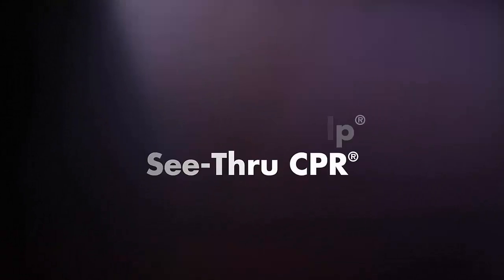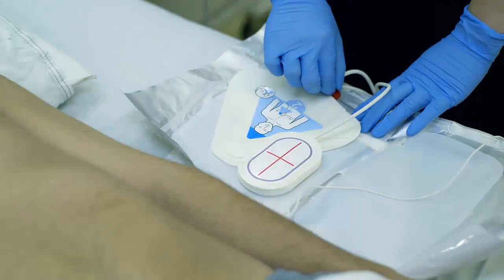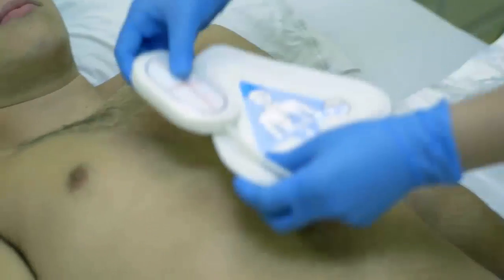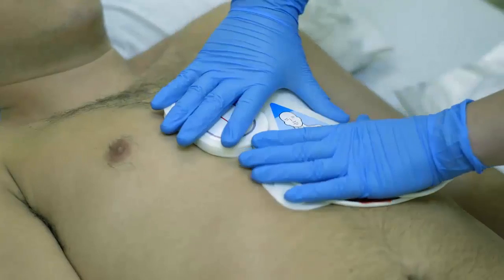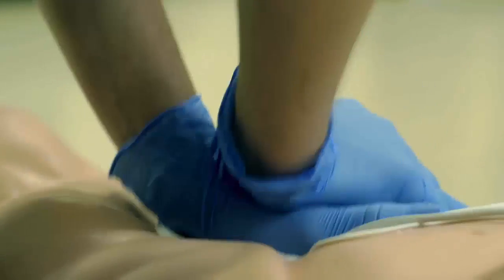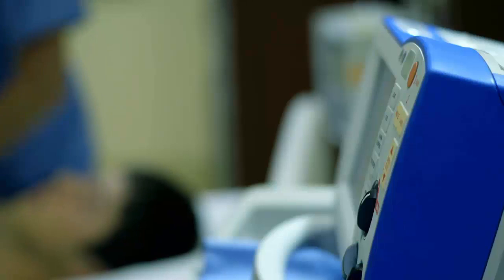Real CPR help and see-through CPR. For adult patients, the One-Step Complete and CPR electrodes include a CPR sensor. The CPR sensor monitors the rate and depth of chest compressions and sends this information to the R-Series.